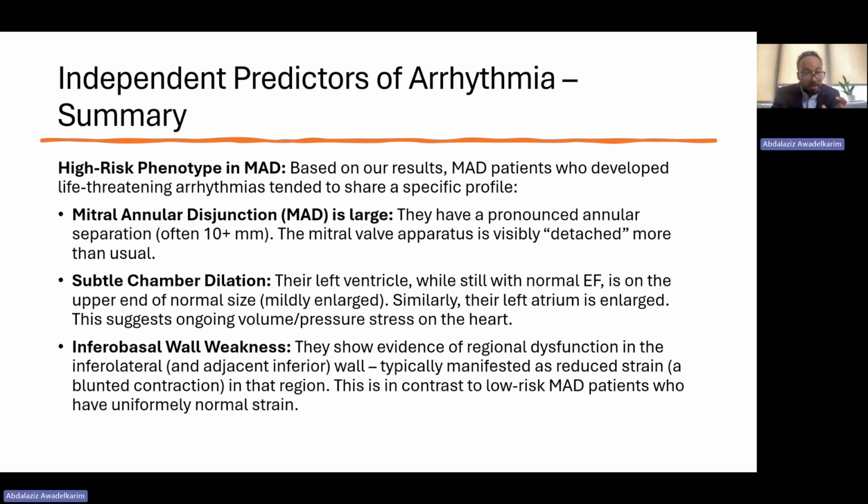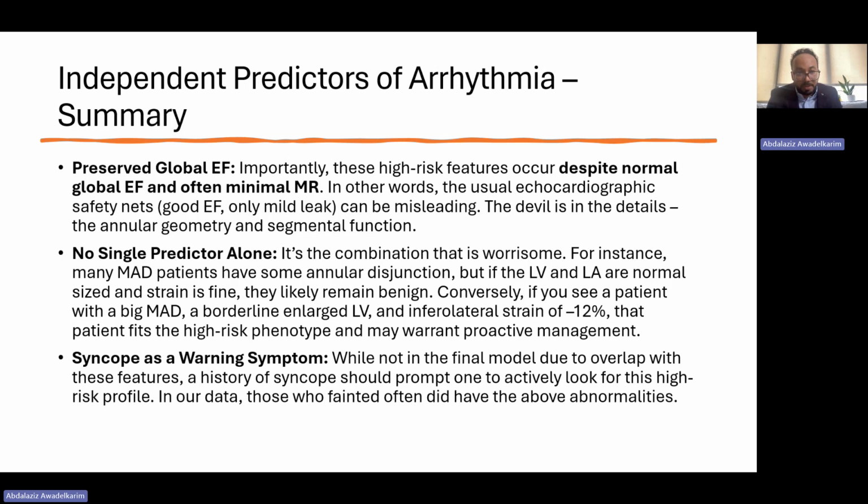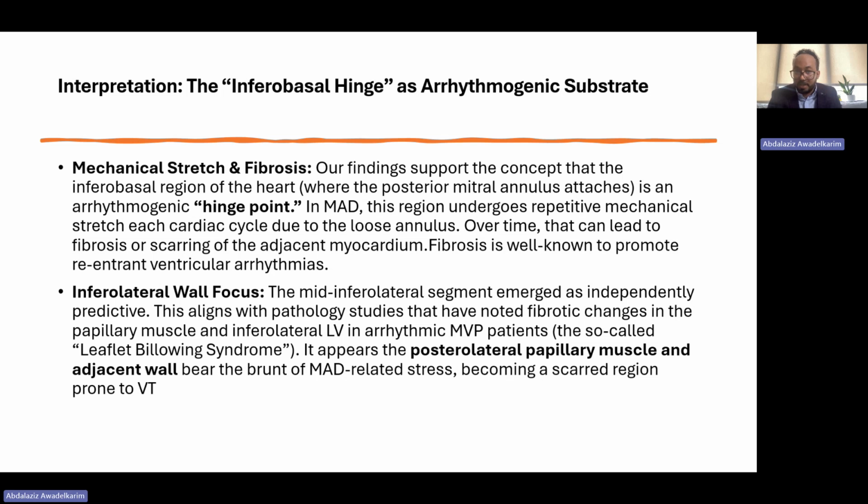And then if there is abnormal chamber size, increased LV dilation, increased LA size, and again to focus on that key area of strain, which is the inferior basal strain. Because as we know, strain usually goes down before even other metrics go down, those people need a more focused or more aggressive form of monitoring. And then syncope. If a patient develops syncope, then it's a warning sign that this patient needs a more aggressive form of cardiac defibrillator and other measures.